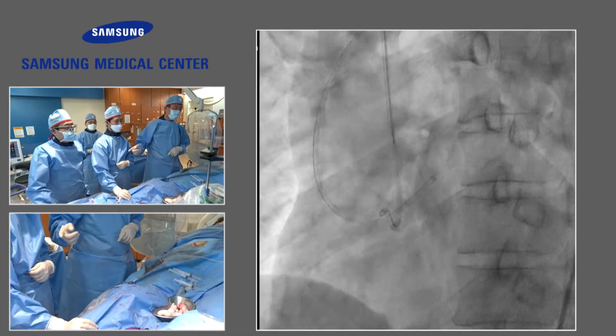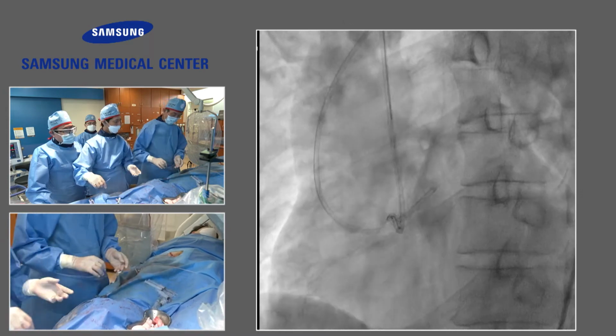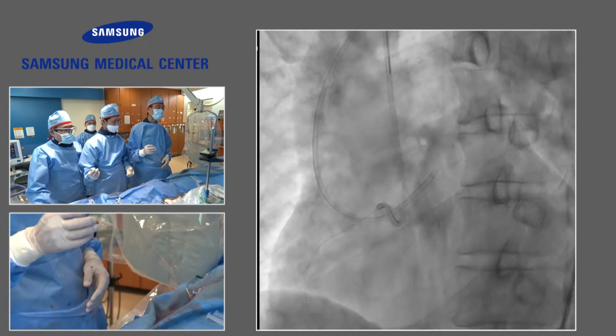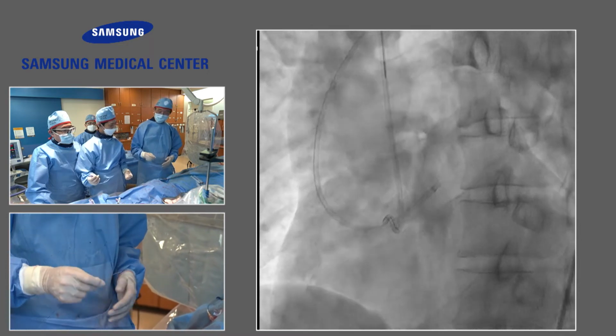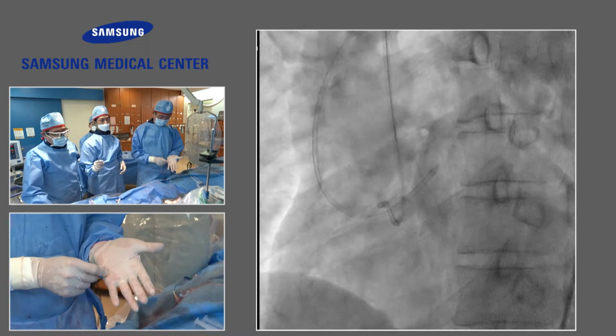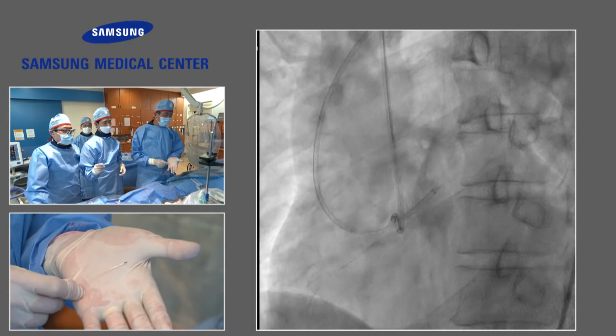But Dr. Lee and my technologist, Seyoung Lim, are inventing a new balloon. He insisted that we have to show that. This is the trap balloon. Sometimes it's like a commercial.